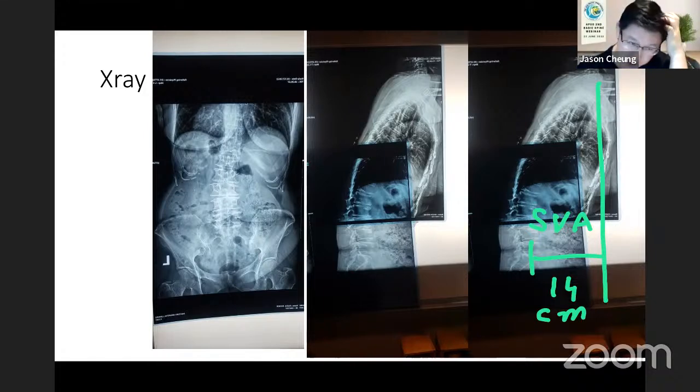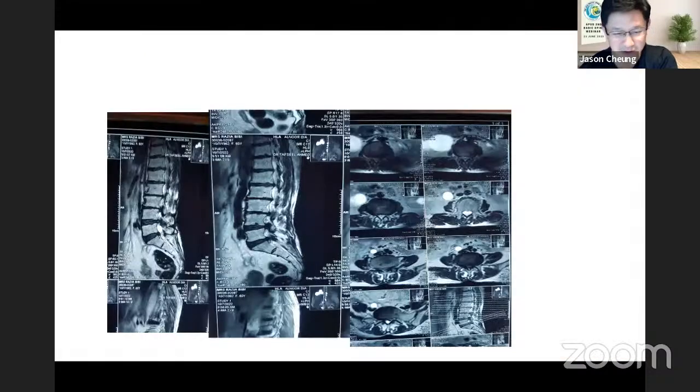But of course, similarly, if this is really a deformity issue, you can see here that the two lowest levels, which are supposed to be two-thirds of the lumbar lordosis in the lumbar spine, are actually essentially neutral, right? So I think the entire lumbar spine has inadequate lordotic restoration. So for me, definitely similar to what Dennis has mentioned, a longer fusion would definitely be warranted past the thoracolumbar junction.